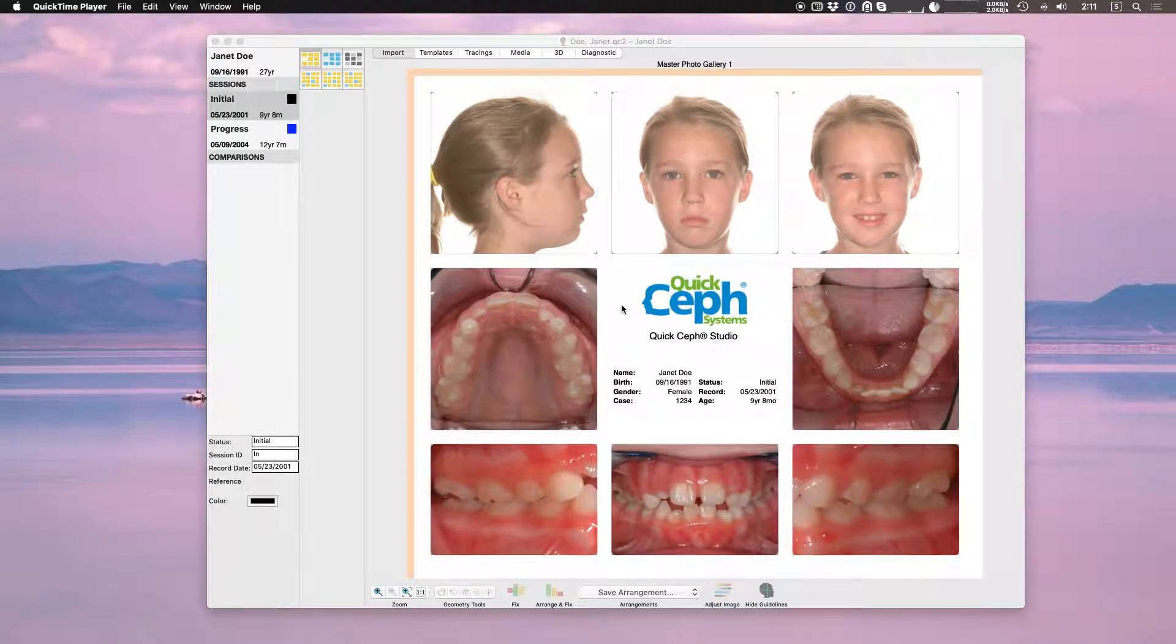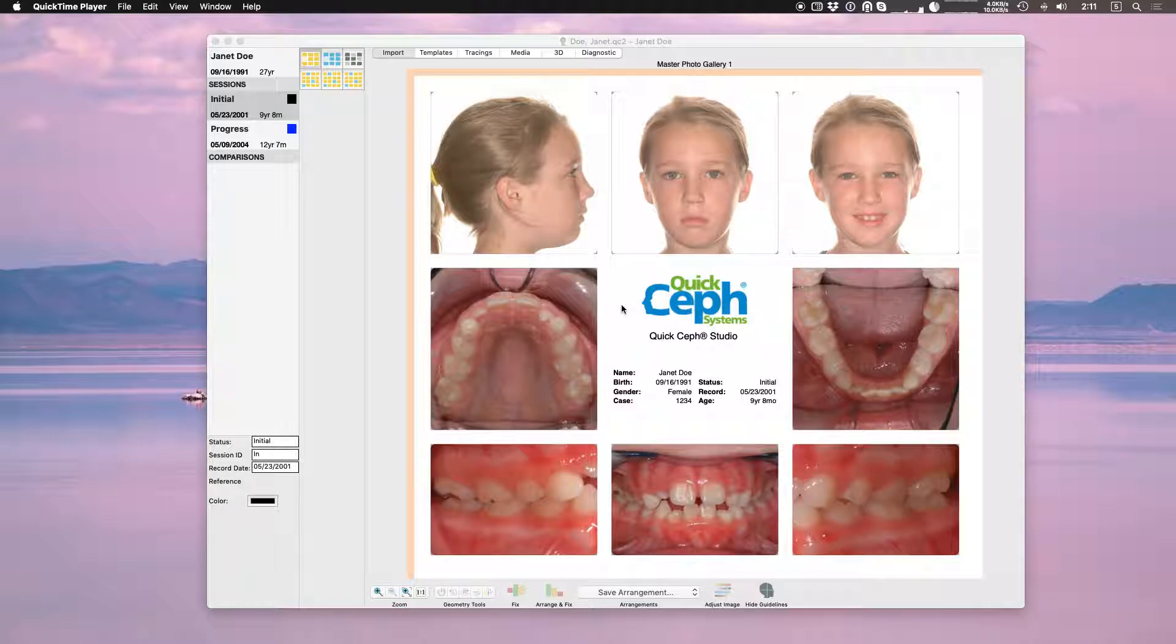Welcome to QuickSuff Studio tutorial videos. In this video I will show you how to perform a superimposition and how to perform a manual superimposition.